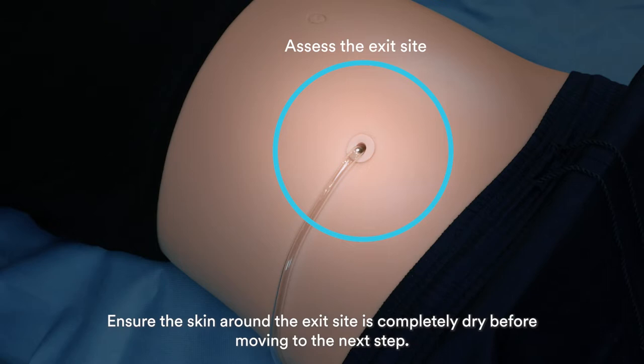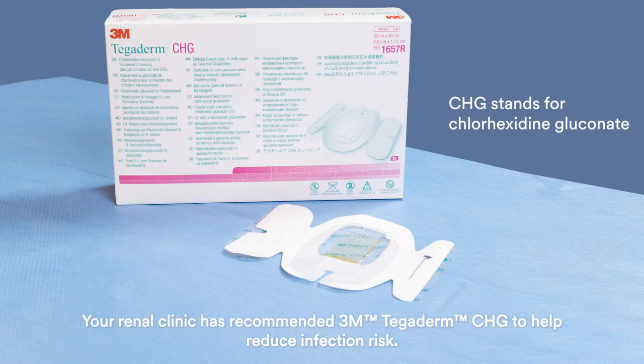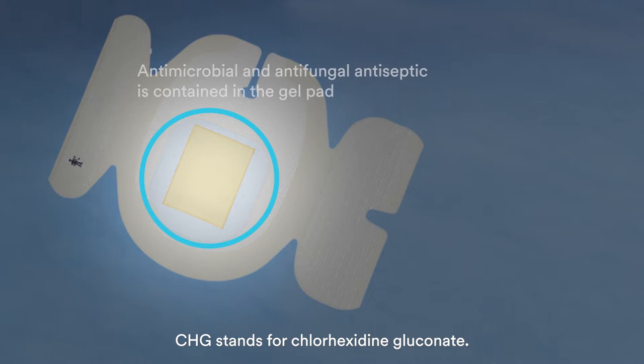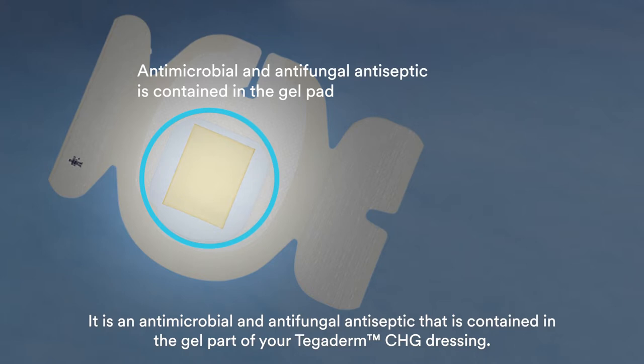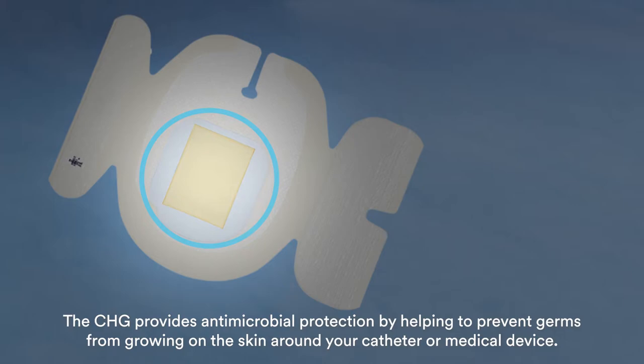Ensure the skin around the exit site is completely dry before moving to the next step. Your renal clinic has recommended 3M Tegaderm CHG to help reduce infection risk. CHG stands for Chlorhexidine Gluconate. It is an antimicrobial and antifungal antiseptic contained in the gel part of your Tegaderm CHG dressing. The CHG provides antimicrobial protection by helping to prevent germs from growing on the skin around your catheter or medical device.